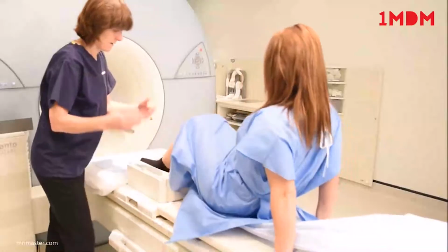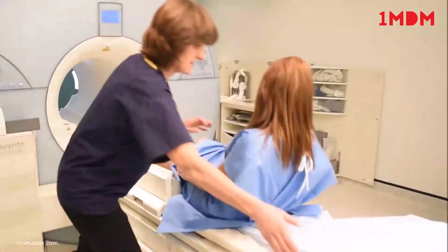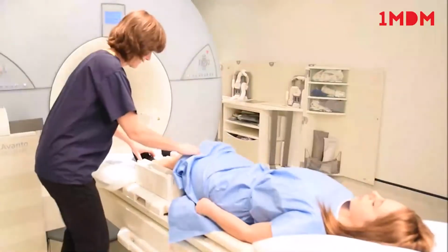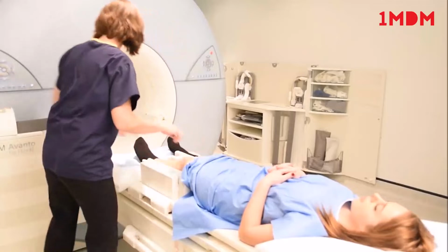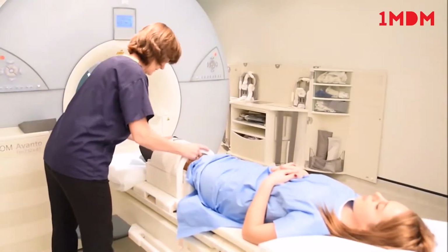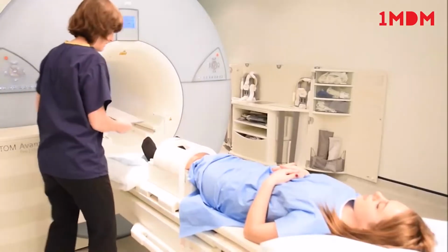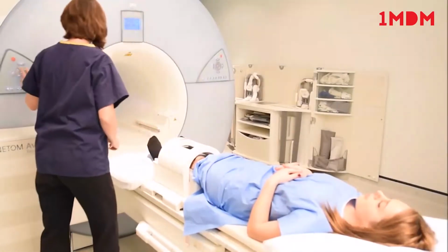Carry out all safety checks before bringing the patient into the scanner room. Help the patient to lie supine on the scanner table with the affected knee in the dedicated knee coil. The apex of the patella should be about 1 centimetre below the centre of the coil. Assemble the coil and place the pads to help the patient keep still.